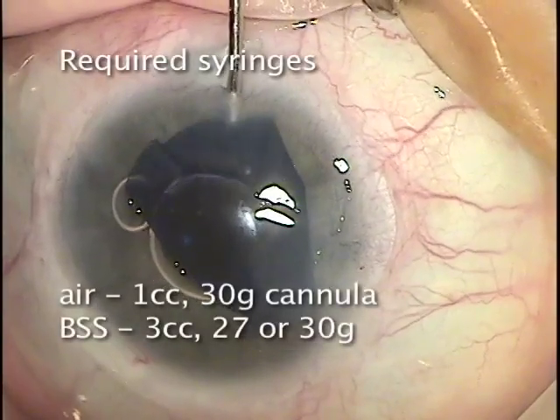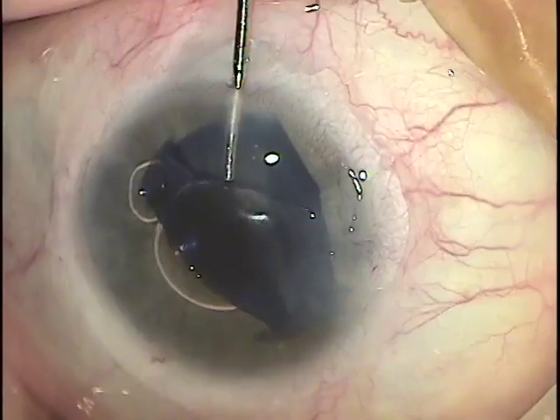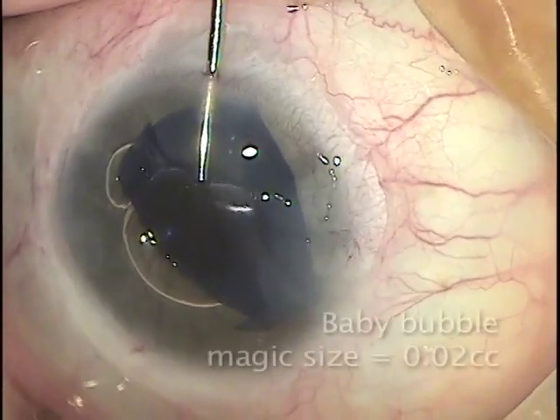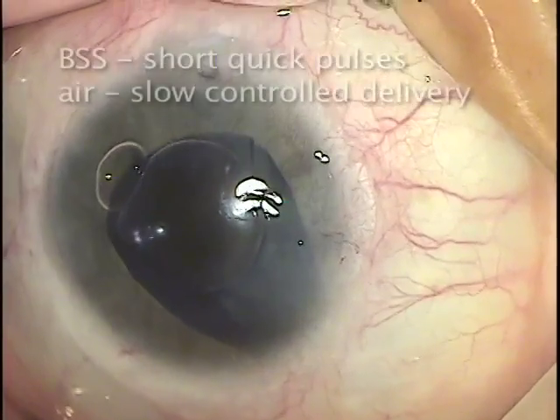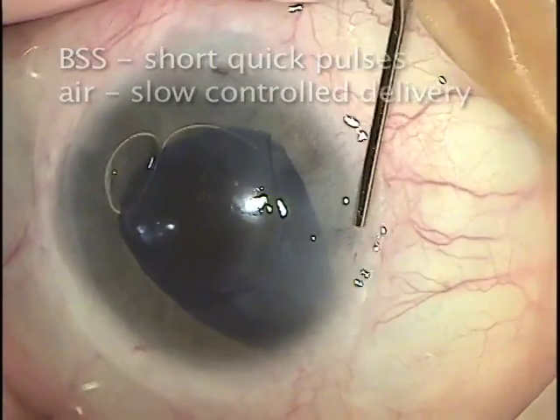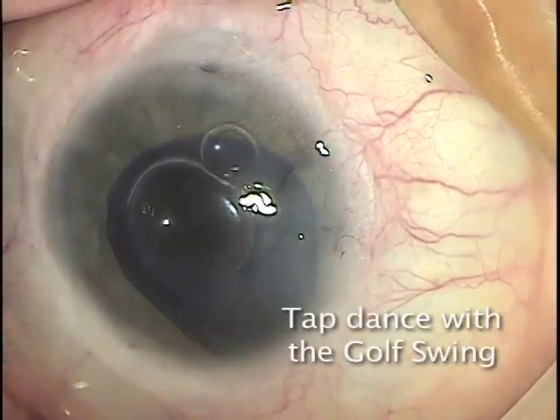We need two syringes: one air syringe of 1 cc and a BSS 3 cc syringe. The initial bubble size should be no larger than 0.02 cc. The BSS is placed with short, quick pulses, while the air is placed in a slow, controlled delivery.